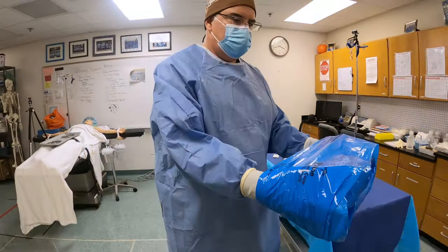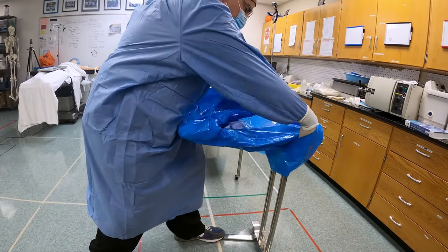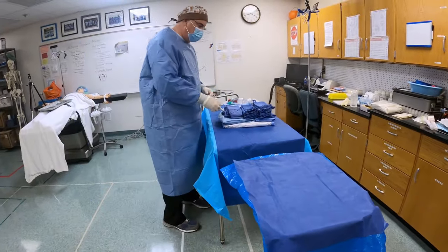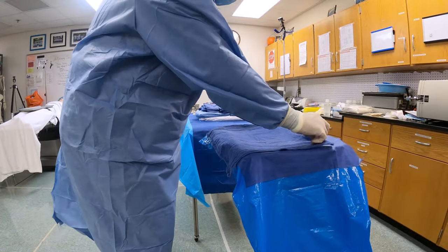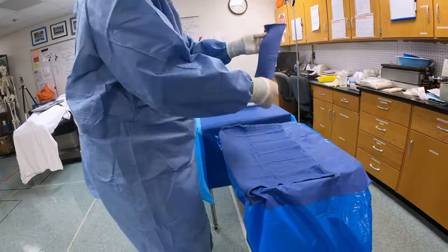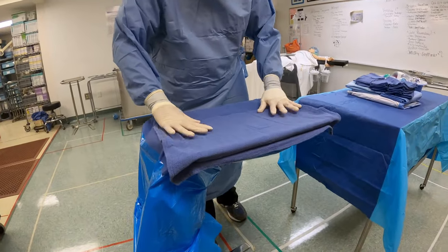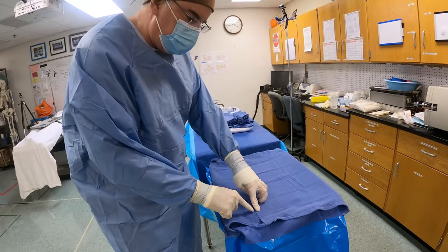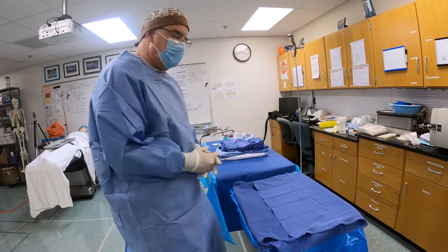Turn my hand sideways — lots of nice room there. Grab it on, then bring my belly up to it so that nothing falls over. Straight out, pull it on. At this point I can turn it to the side and come over here. You can also strike the towel off the mayo stand — yes, the towels can go over the edge of the mayo stand. This is the only case where they can because we're sterile all the way around. Tuck it under, and do the same thing from this side. If you had ties — this would be suture that does not have a needle on it — you could place it under here, folding this over so just a little tab is sticking out, so you can press your hand here and pull a single tie out while leaving the rest in place without getting tangled.